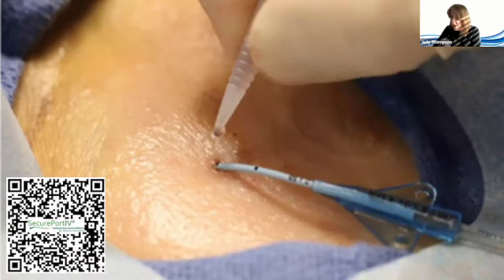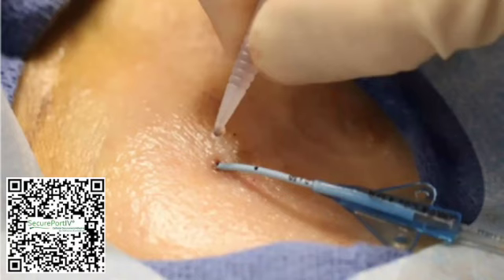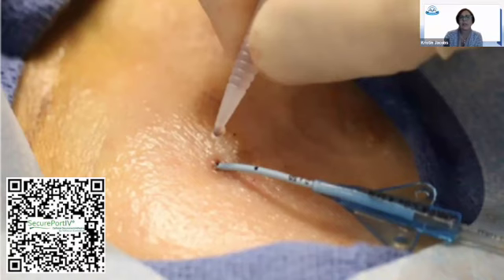Surgicel was quite a bit more expensive when I was using it. Even more than that. Quite a bit. Okay. It's my understanding that products like Surgicel are more for a wound, like if they would go into a wound, and they're not meant to stay on for 7 days. So then you'd have to come in and change the dressing sooner than you'd really want to.